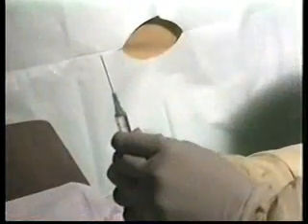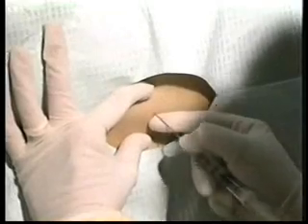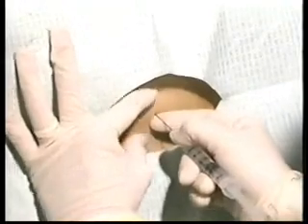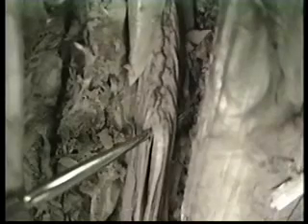Once the skin has been numbed, use the 21-gauge needle to infiltrate deeply. Anesthesia should last about 20 minutes. Are you doing okay? Now I'm going to start numbing deeper. Aspirate before injection to assure that you are not in the subarachnoid space or in a blood vessel. The spinal cord is highly vascularized by the anterior spinal, the posterior spinal, and the radicular arteries.